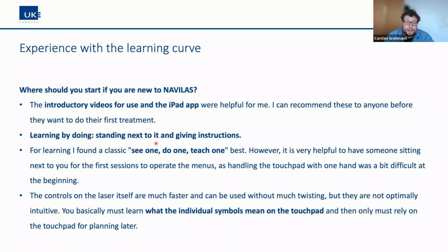Learning by doing, standing next to it and giving instructions. For learning, I found the classic see one, do one, teach one best. However, it is very helpful to have someone sitting next to me for the first sessions to operate the menus. Handling the touchpad with one hand was a bit difficult at the beginning.